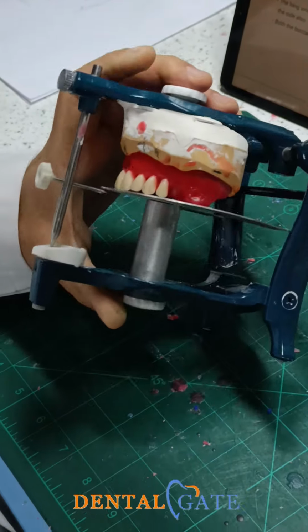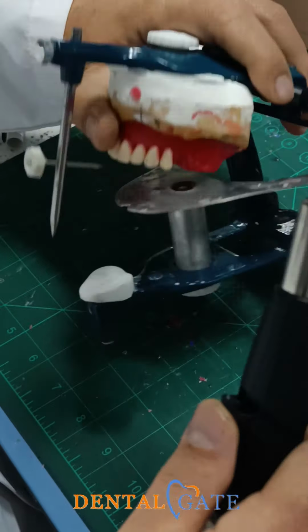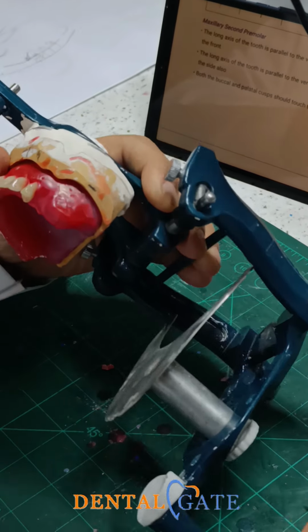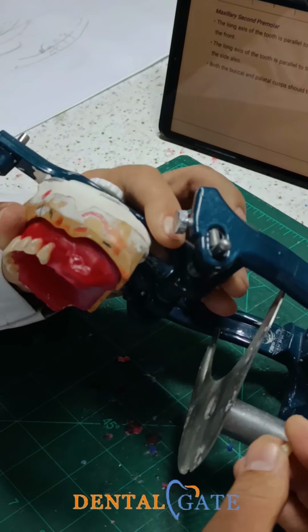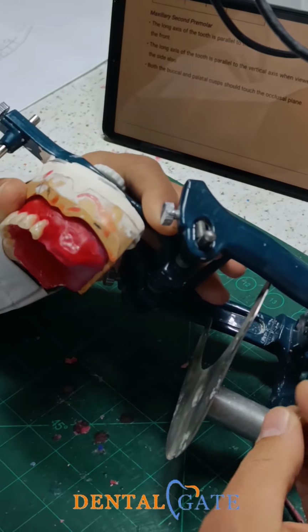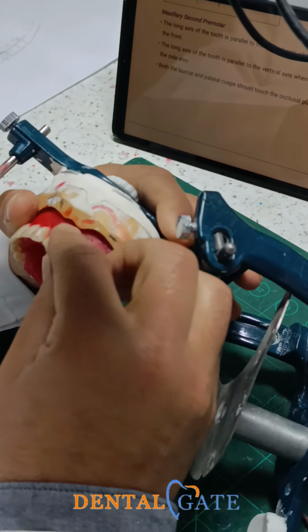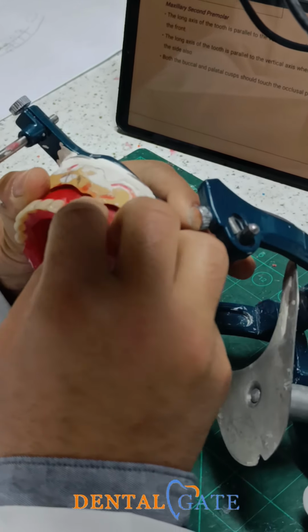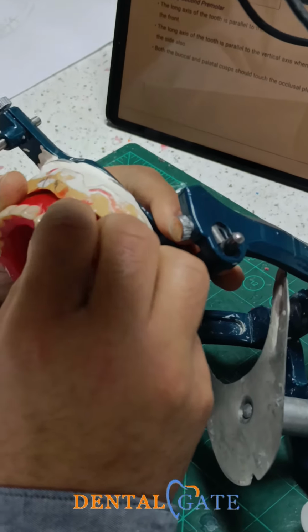So make it with the understanding that both cusps should touch the table now, because the neutral one has no curve here. Not a curve, because the curve will be shallow here, okay?